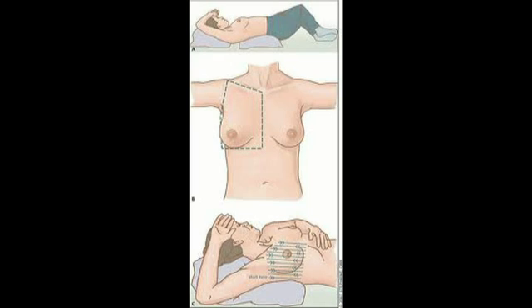Flattening of the breast reduces the tissue thickness, improves sound penetration, reduces acoustic shadow and provides a better image. In women with large breasts, a wedged pillow is placed behind the shoulder of the examined side to minimise tissue thickness. In larger breasts, part of the parenchyma may fall laterally and we may need to shift the patient even more laterally.